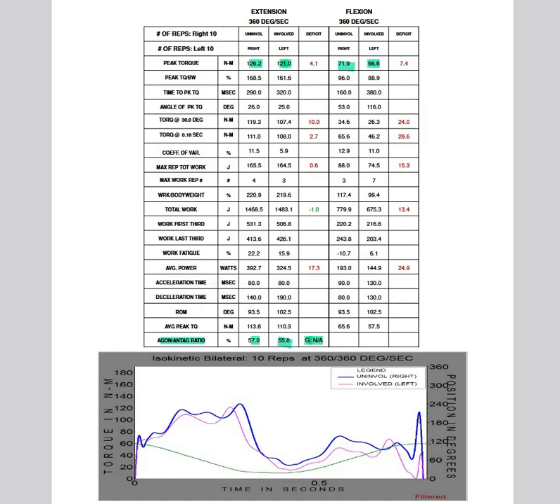And the accuracy of that prediction is increased with the mixed ratio, so mixed angular velocities with mixed muscle actions, an eccentric concentric test, and is lowest with a concentric test like we've done here. But we've done this for time constraints, practicality, and ease of testing. So it's not something that you need to critique so much in your data analysis.